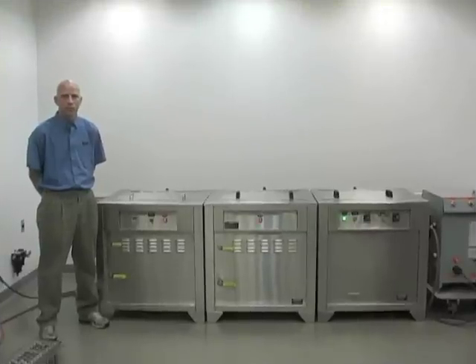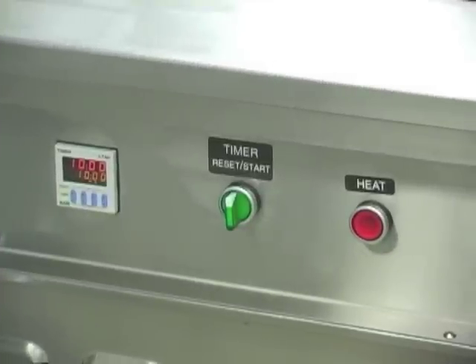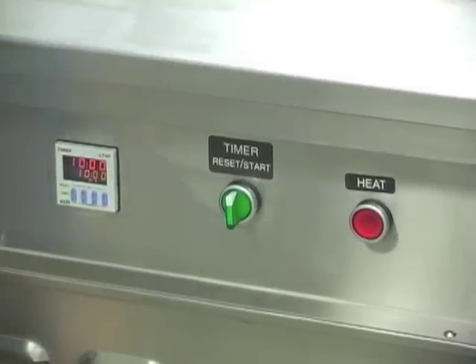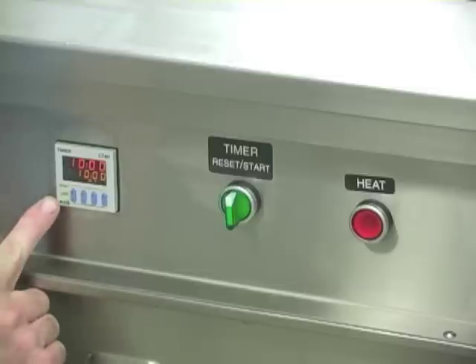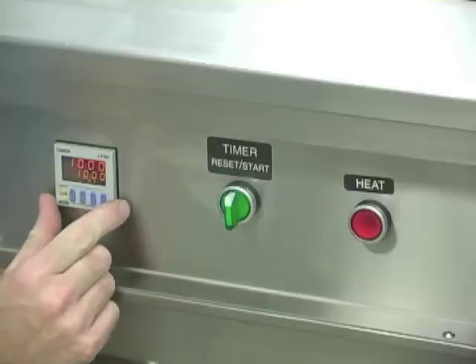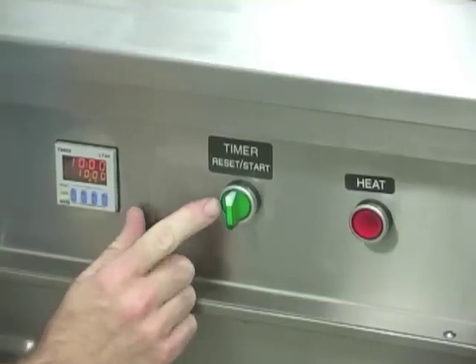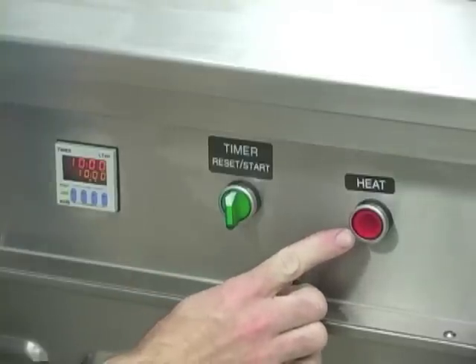This is the instructional video for the Natoli Engineering ultrasonic wash, rinse, and dry unit. Here we have the Natoli Engineering ultrasonic wash unit. On the front panel we have three controls: the run timer, the timer start and reset. The run timer is for the ultrasonic run time. You start it with the start button, and there is a heat power on and off button.